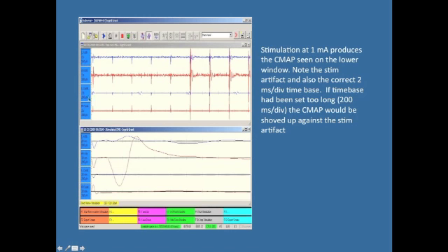You'll notice here on the control, again, remember I told you the control was the trapezius. You see this? That's EKG. All right, you're recording EKG. All right, and you can figure out the frequency. All right, so if this is a 2-second window, right, and we have 4 responses, what do you think we have?